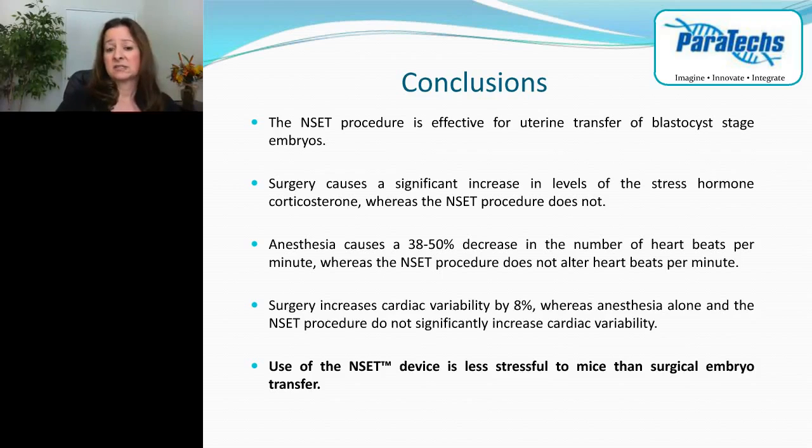Use of the NSET device is therefore less stressful to the mice than a surgical embryo transfer. And as such, it is a successful alternative to a surgical procedure and a 3 Rs refinement for a currently used technique.